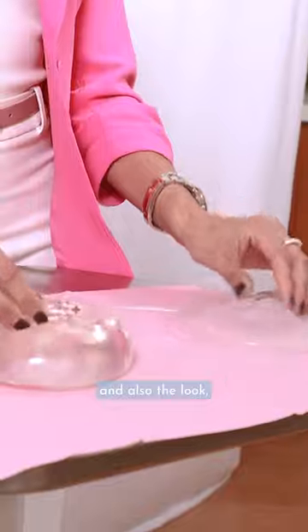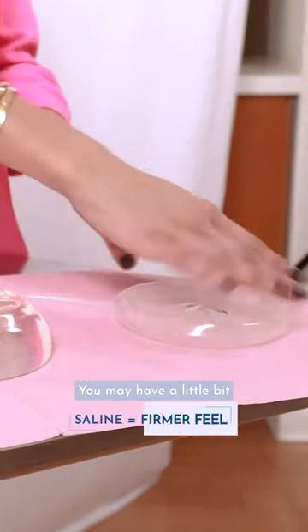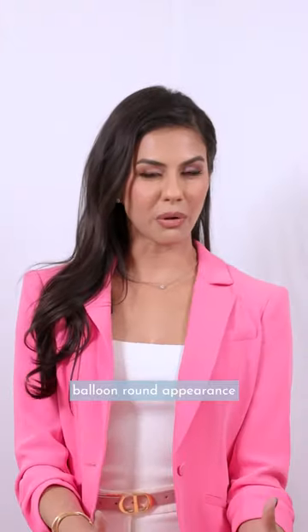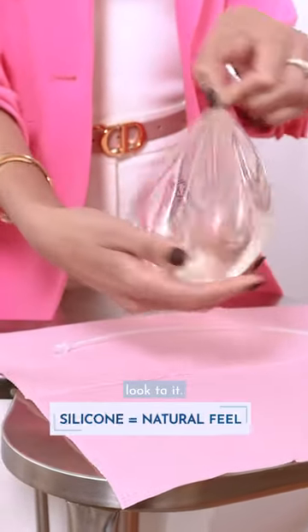The main difference in these is going to be the feel and also the look, because in your saline implant, it's more of a water balloon. You may have a little bit more rippling, and you may also be able to see more of that balloon round appearance, compared to a silicone implant, which has a much more natural look to it.